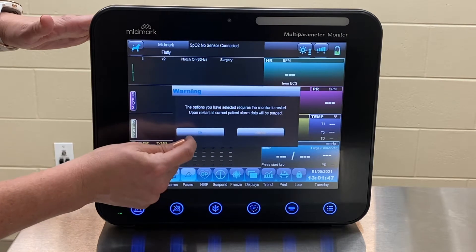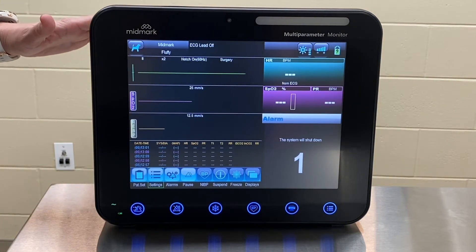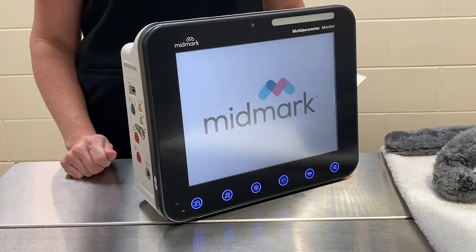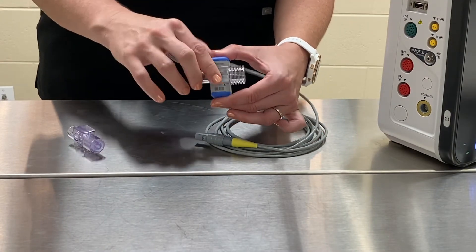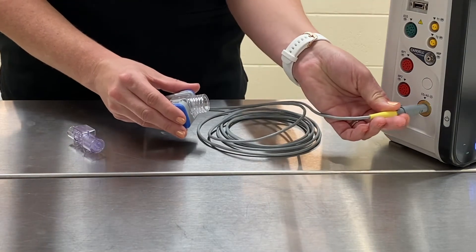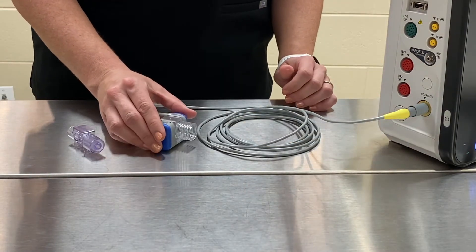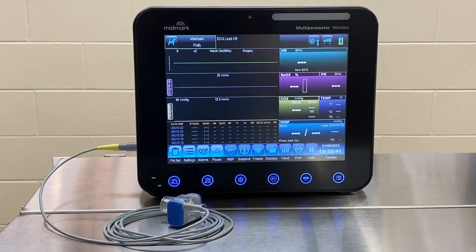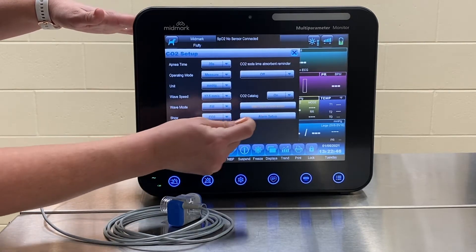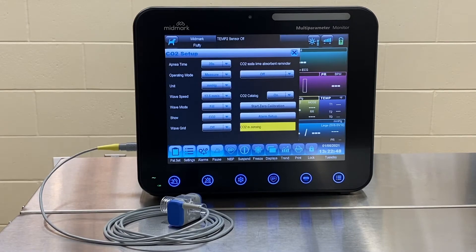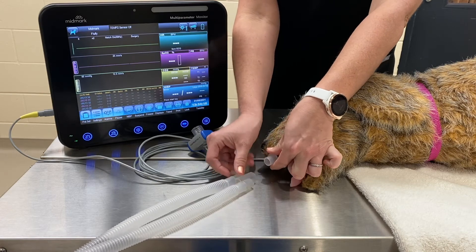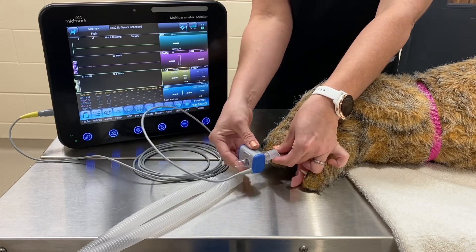Press X in the upper right corner and select OK to shut down the monitor. Turn the monitor back on by pressing the power button. Next, gently insert the appropriate size adapter or filter line into the CO2 sensor. Plug the CO2 cable into the CO2 port on the side of the monitor. Allow the sensor to warm up and then start the zero calibration by pressing the CO2 waveform and pressing Start Zero Calibration. The sensor is attached between the endotracheal tube and the breathing circuit, with the logo facing upwards.